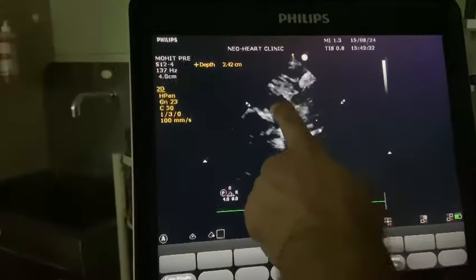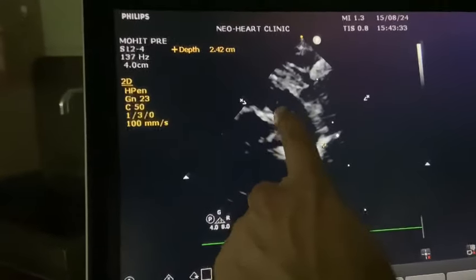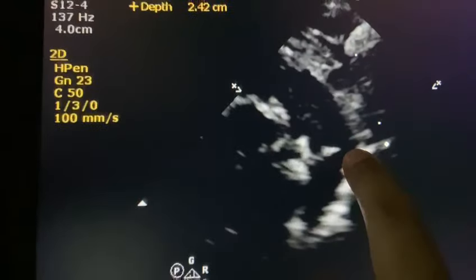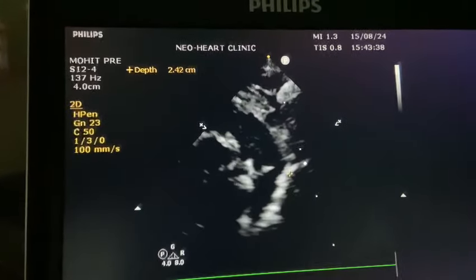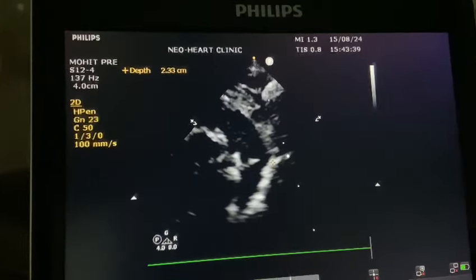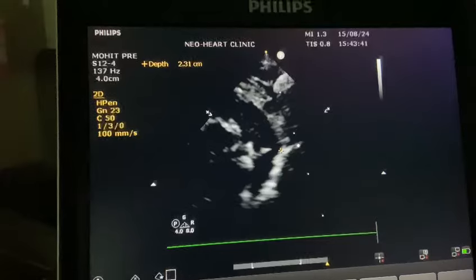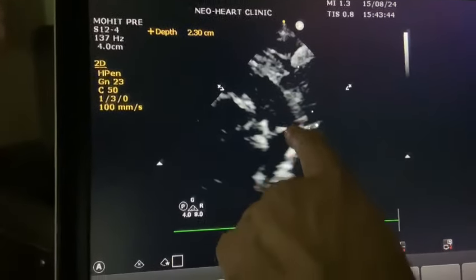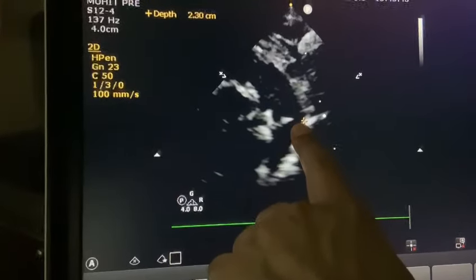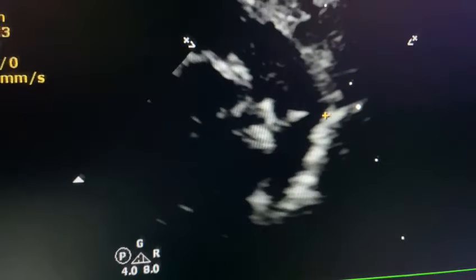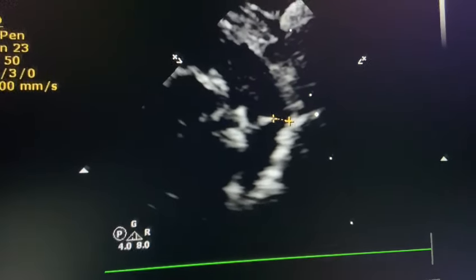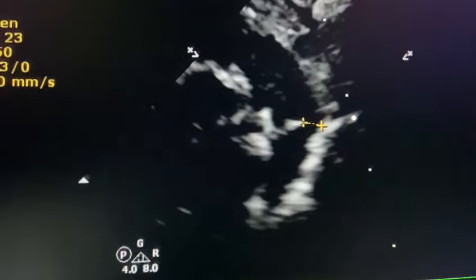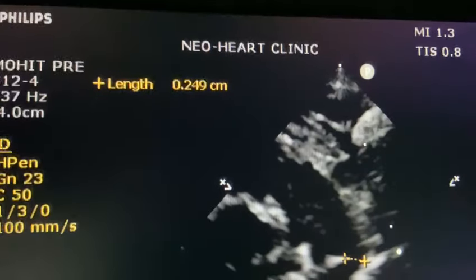When we take the size — so now this is LPA, RPA, LPA, and this is the PDA from the descending aorta. This is where the PDA is entering the pulmonary artery. So we take the size in 2D: the size of the PDA where it enters the pulmonary artery. This is where it is entering the pulmonary artery. The size of the PDA is 2.5 mm.